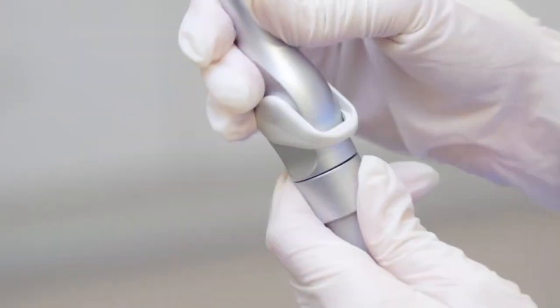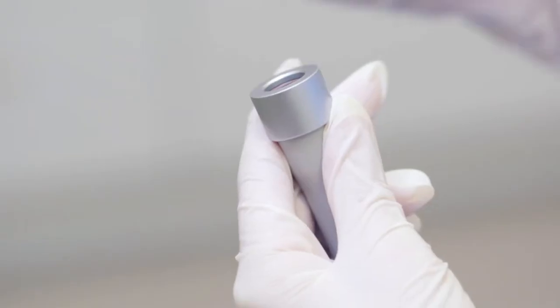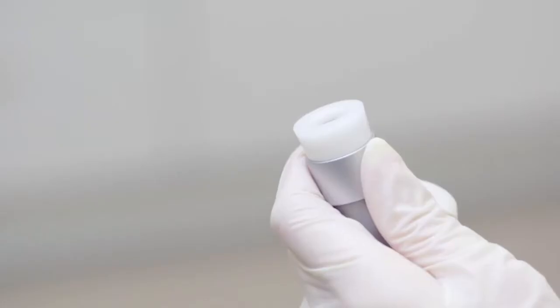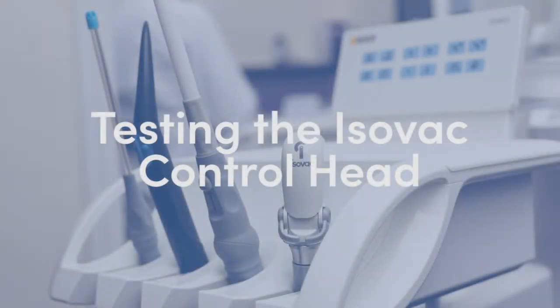To install, remove your existing valve from the HVE coupler. Attach the Pelton and Crane style connector onto the HVE coupler. Attach Isovac onto the Pelton and Crane style connector. Press firmly in place.